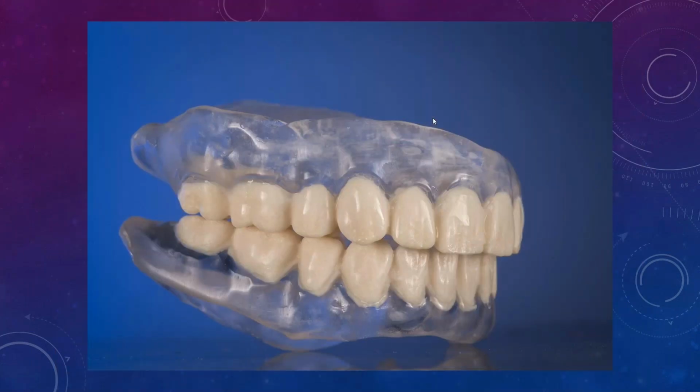One other way, there's two ways to do a CT scan for your patients where you're doing planning for surgery. Now, there's a dual scan protocol and there's a single scan protocol. Dual scan utilizes what I showed you previously, right? Where you've got a duplicate denture with scan markers, or you put scan markers on a denture with beads, or you use stickers.